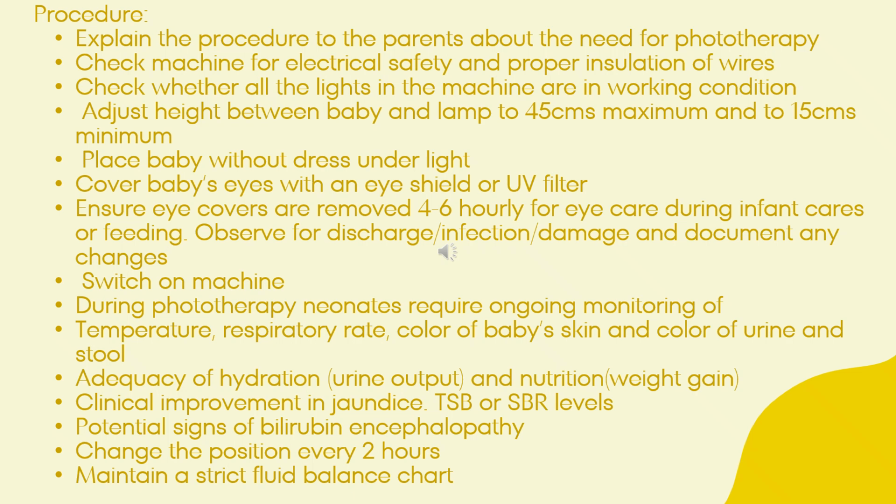So after checking that, adjust the height between the baby and the lamp. The ideal height should be 45 centimeters. The minimum height can be up to 15 centimeters. Place the baby without dress. Cover baby's eyes with an eye shield or UV filter goggles.